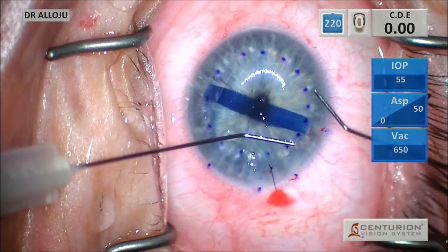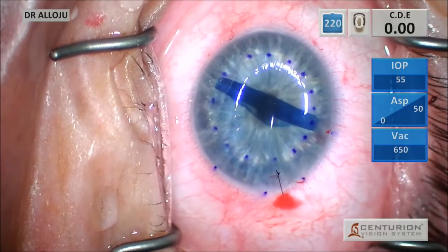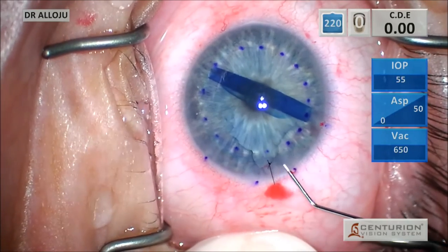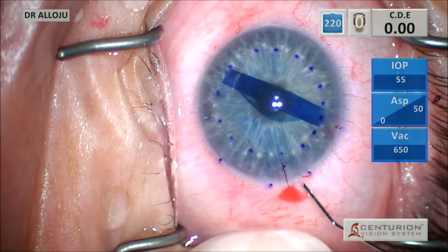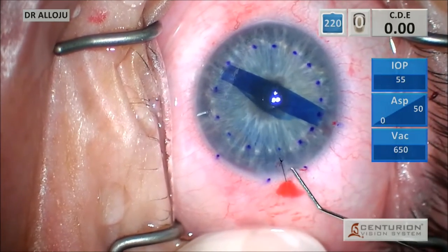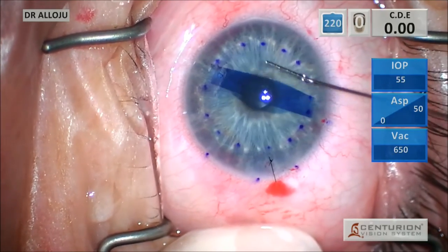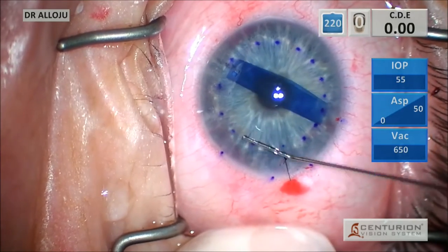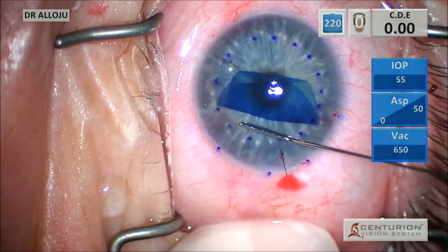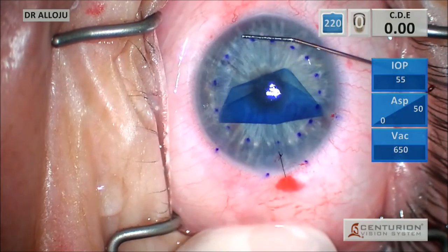So here all I'm basically doing is slowly getting the graft into position and shallowing the chamber as much as possible. Now in this patient, not only is the chamber shallowing, it's actually collapsing, and that actually will end up working against you when you're trying to position the graft. And in these cases, you have to, at least in my experience, essentially put some pressure on the side of the eye to help form a chamber.